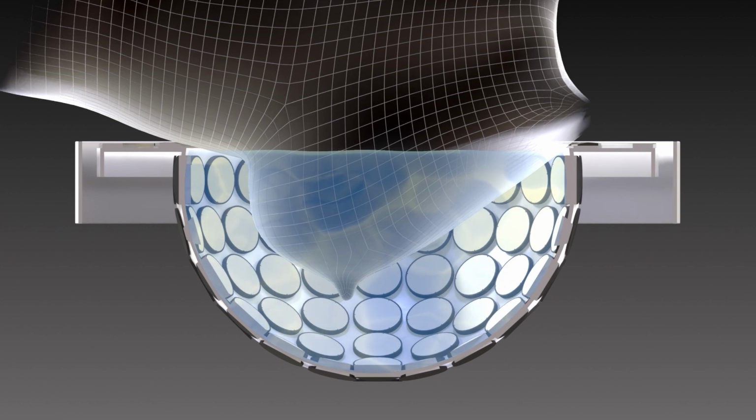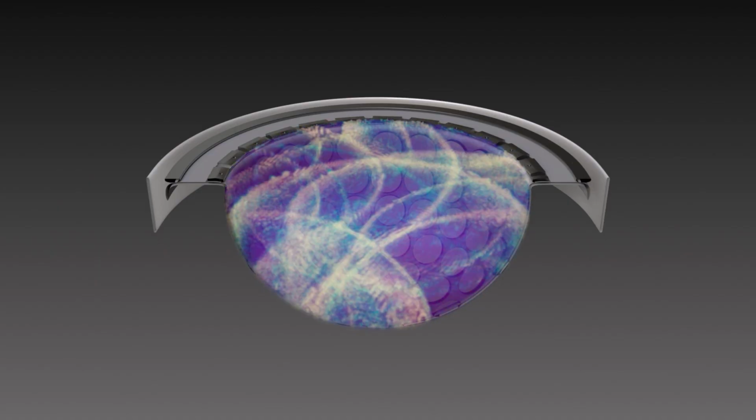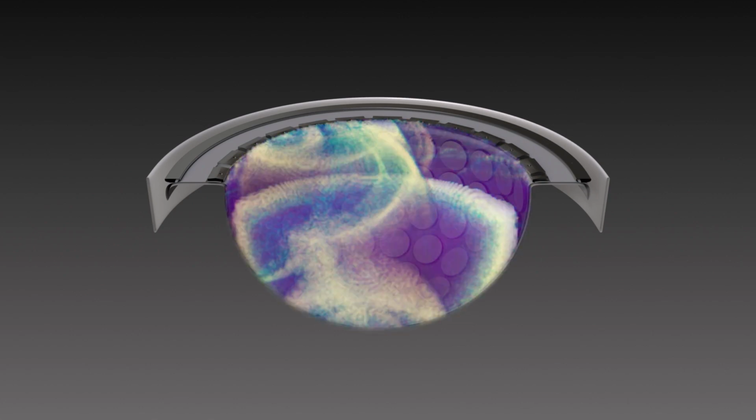Once the data is acquired for a particular person, we start a process which we call the generation of a digital twin of that person and the device itself. And from that moment on, we try to simulate the outcome of ultrasound waves traveling through this tissue, which is not exactly what has happened in reality, but we can measure the differences between the synthetic data, that product of our digital twin, and what has actually happened in the real world.